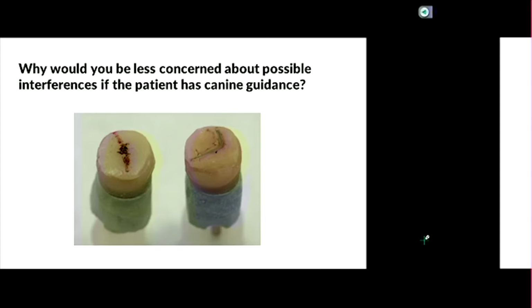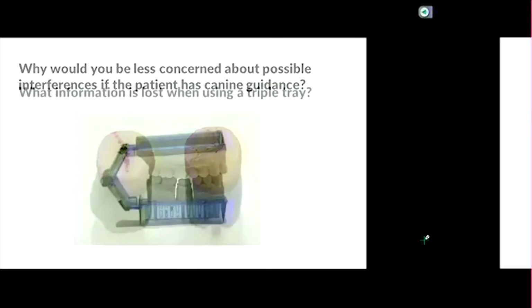So let's say you make those cusp tips really high because you think, oh, I've got plenty of space to clear it. So I take that same crown and put it in the patient's mouth, and in reality, they're at 30, so when they move to the side, the space that you thought was there wasn't actually there. Now you're hitting. Okay? So think about that. If you don't get it today, that's fine. But eventually, at some point, it'd be good to understand.